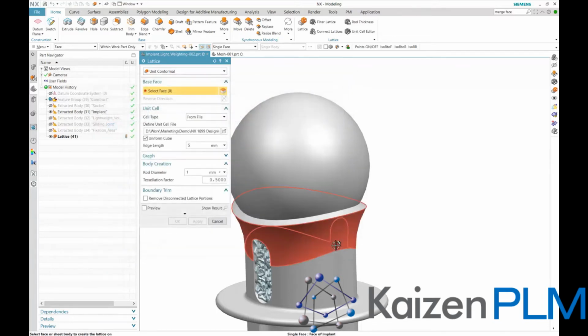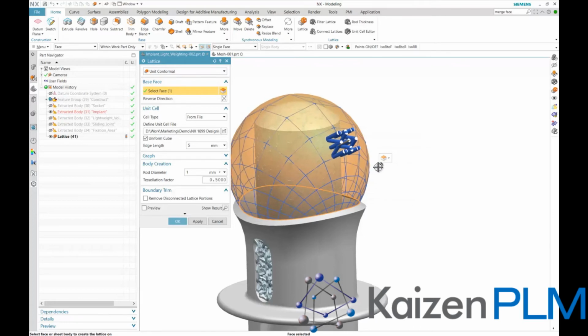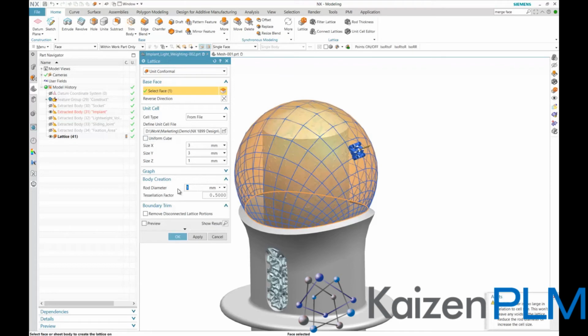As this mesh is created to firmly fixate the polymeric layer to the ball, and since the polymeric layer is rather thin, we toggle off the uniform cube option and set the size to our requirements. We also reduce the rod size before accepting the result.